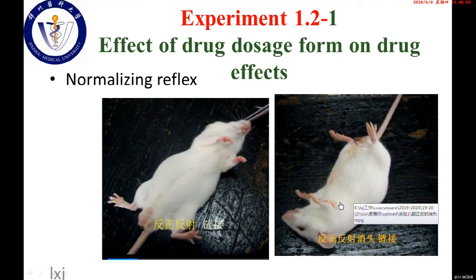But when pentobarbital or other anesthetics take their pharmacological effects to induce anesthesia, the animal will lose this ability, lose their normalizing reflex. Like this one.